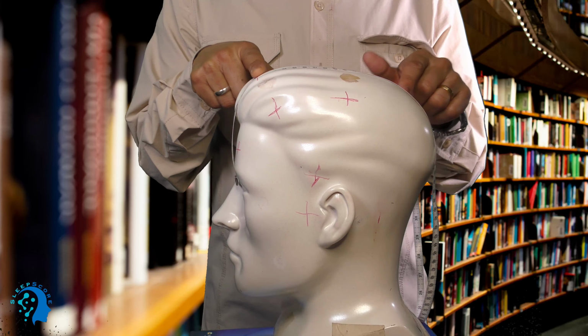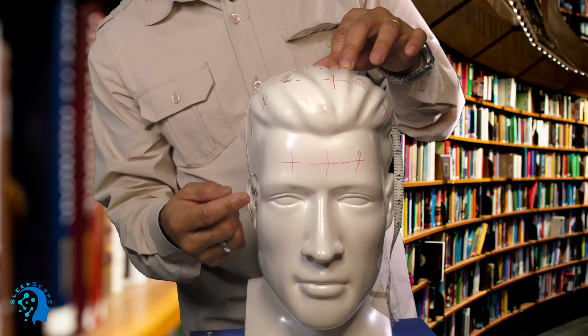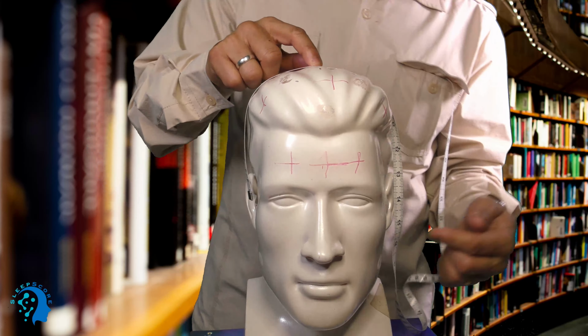Now I'm going to do preauricular to preauricular. I measure from preauricular to preauricular like this, and I mark half right here. Then I go 10% up, 10% up, and I go 20%. From the center, I went 20%, 20% on either side. So I'm done with my C-axis too, preauricular to preauricular.